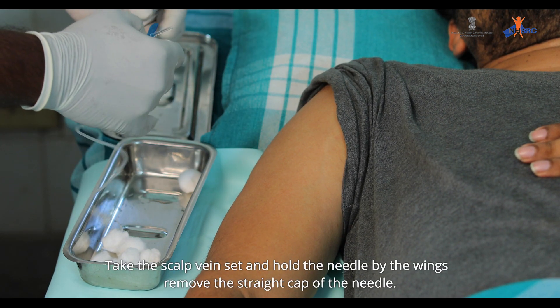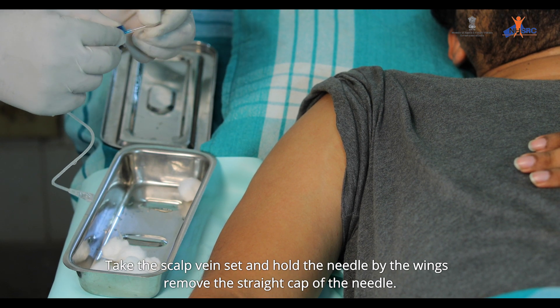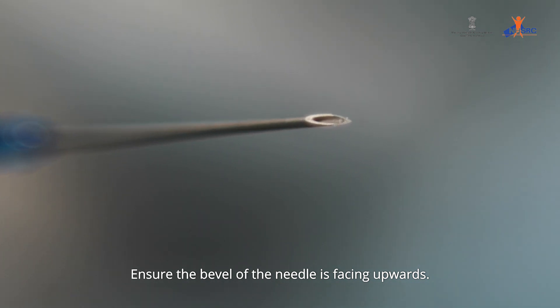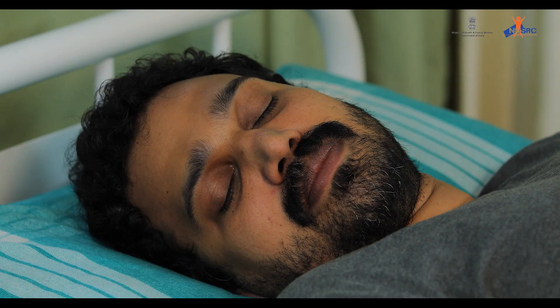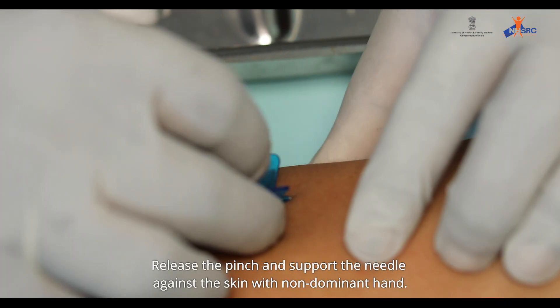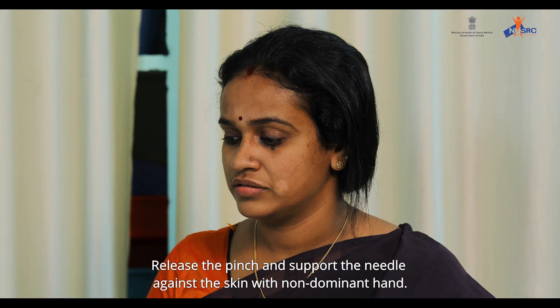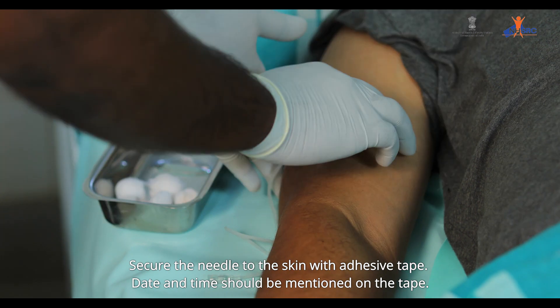Take the scalp vein set and hold the needle by the wings. Remove the straight cap of the needle. Ensure the bevel of the needle is facing upwards. Pinch the skin with the non-dominant hand and insert the needle at a 30 to 45 degree angle into the subcutaneous tissue. Release the pinch and support the needle against the skin with the non-dominant hand.